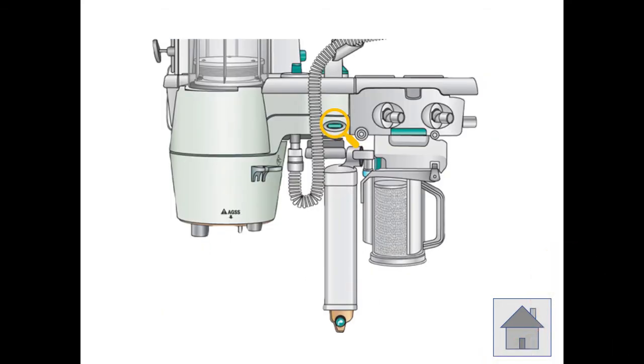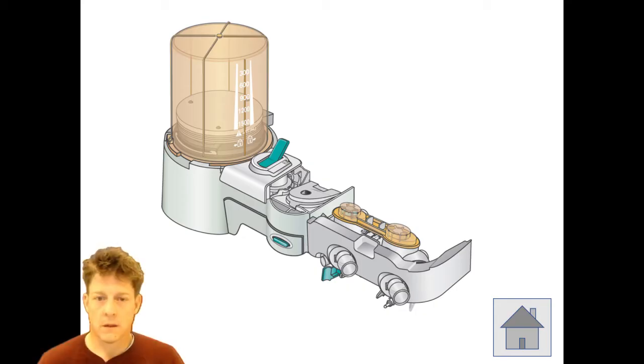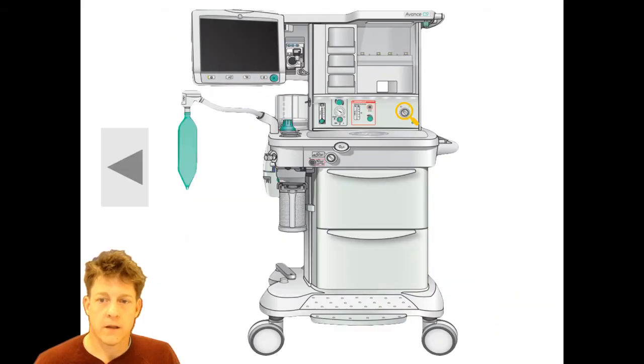And as you can see, I now have a magnifying glass to open up the ABS. I can hit that, and it's going to open up and take out the ABS itself, so I can start talking about the ABS. So that's all the outside components of the anesthesia delivery system. I'm going to hit the home key again and bring us back to the front.